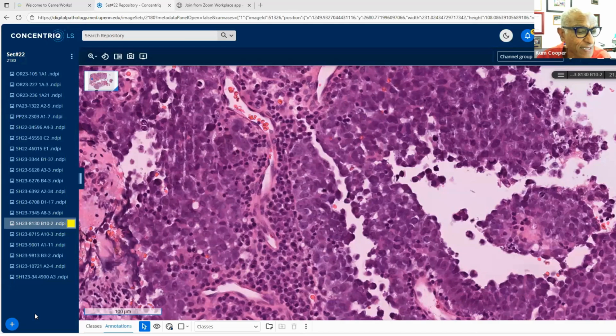There you go, Fernanda. That's NUT. Yes, correct, NUT carcinoma. Not to forget that. If you have the antibody, it's good. D is DECAF. DECAF is DEK, AFF. Those two genes fuse to be the molecular signature of these recently described carcinomas in the sinonasal tract.